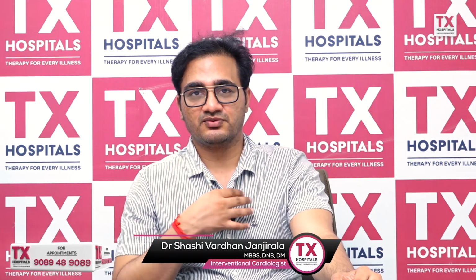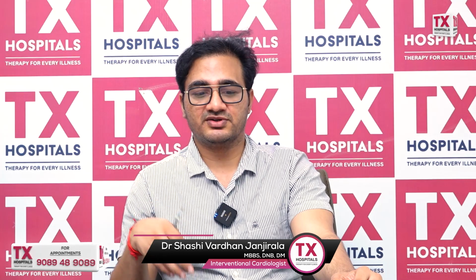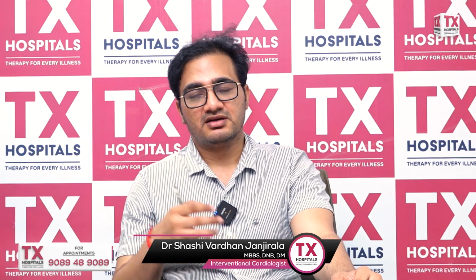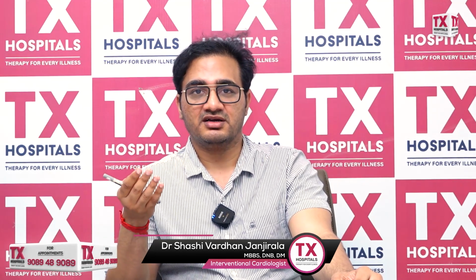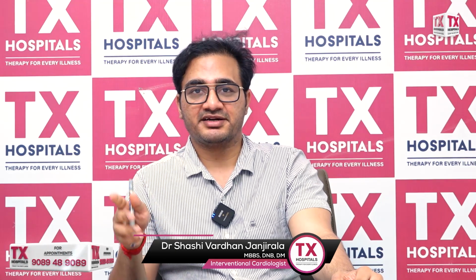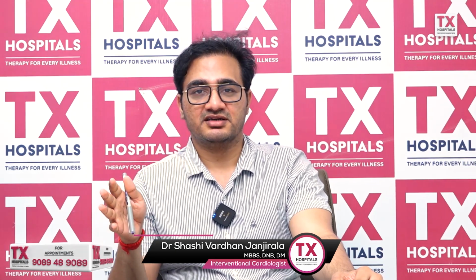Then we evaluate the lower limb blood vessels. What we usually do is a peripheral angiogram. Like the angiogram we do for the coronary arteries, there is an angiogram for the lower limb blood vessels. If there is a blockage in blood vessels like the femoral arteries, popliteal arteries, or below-knee arteries like the anterior tibial, posterior tibial and peroneal arteries, then we open the blood vessels using stents. We put a metal across the blood vessel so that it doesn't close back. So these are the preliminary indications where we usually do interventional procedures with stents.